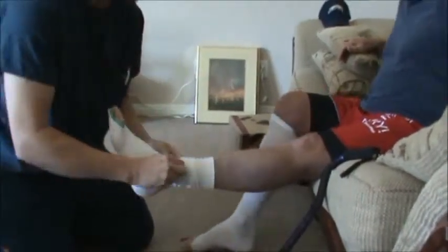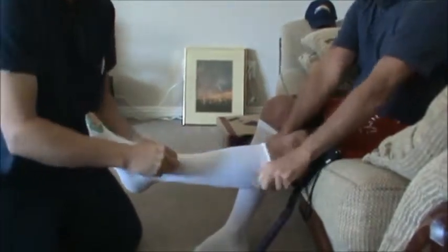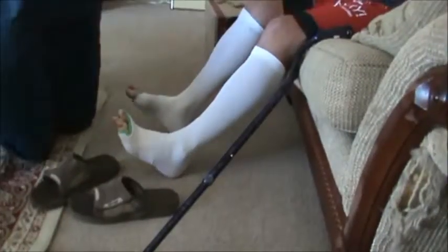Support that leg where you pull some traction back, so that you're not jamming. Then the patient can pull the rest up on their own so that they know their own pain tolerance. And there you have it.